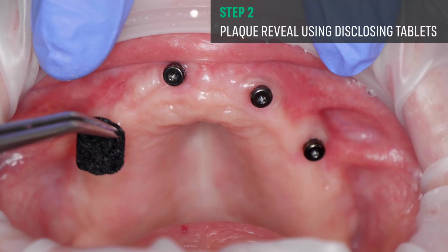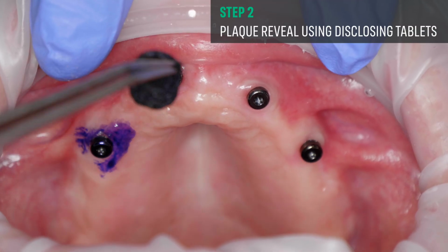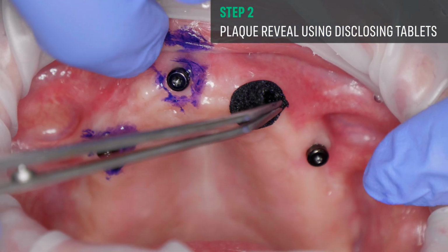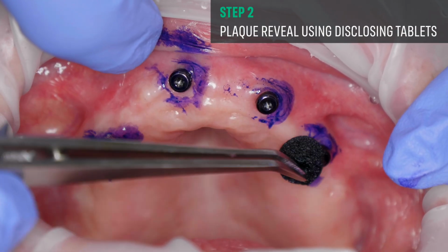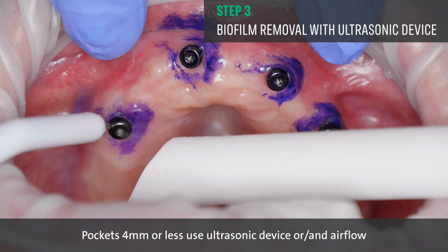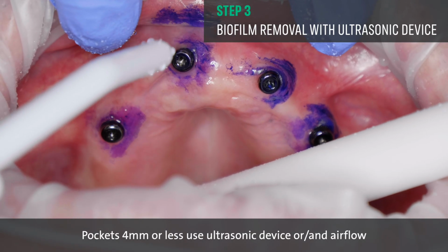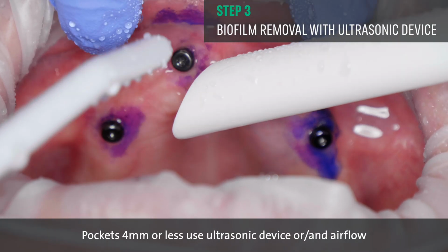I'm going to paint on some disclosing solution to show any biofilm. Bit of a shower.